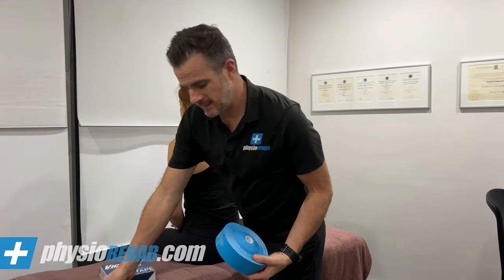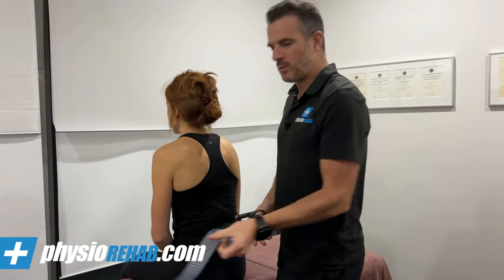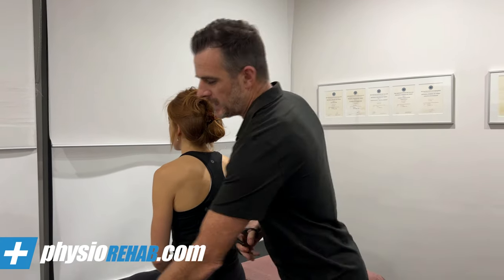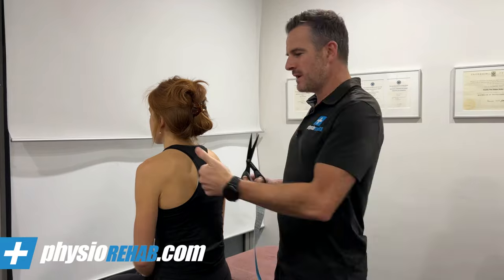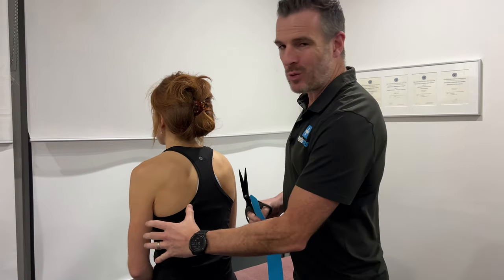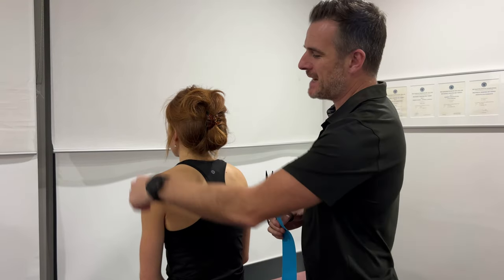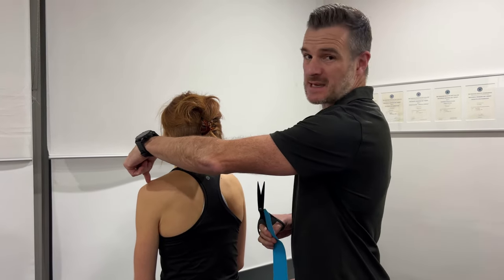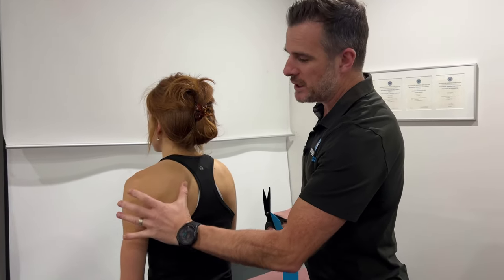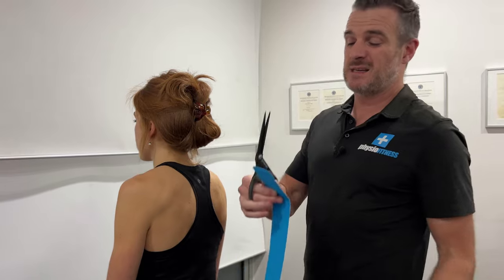What you need is kinesio tape. With all kinesio tape, you've got to work out what percentage stretch you're going to tape with — meaning how much stretch you're going to put on. It's quite a lot for this one because we've got to take the whole weight of the shoulder out. The shoulder is almost sitting there in muscle suspension — the only bony attachment is the AC joint. So this muscle system is what's keeping that shoulder in position, and we're going to lift the whole shoulder up. You're going to need quite a bit of tension, hence it needs to be elastic.